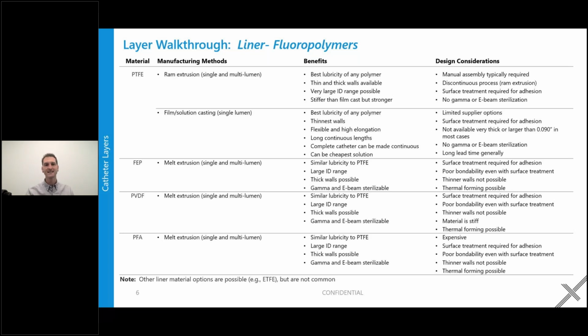The big problem with PTFE, and it's becoming a much bigger problem more recently with the EPA cracking down on ethylene oxide, ETO or EO sterilization methods, is PTFE cannot be run through radiation type sterilization methods. The radiation breaks the bonds in the molecule and it turns to dust, and it is no longer the liner that you put in the product.